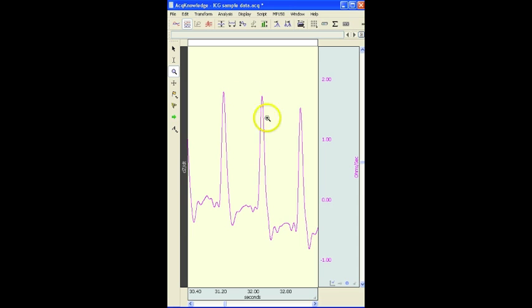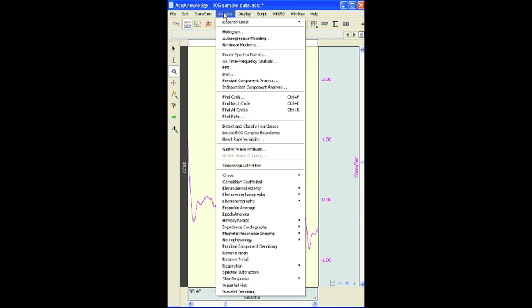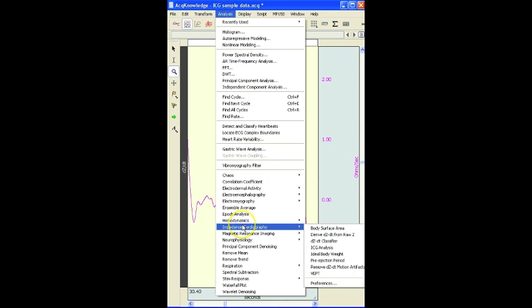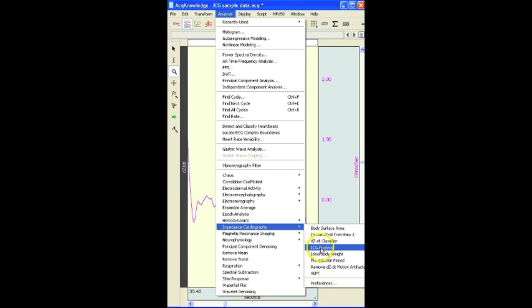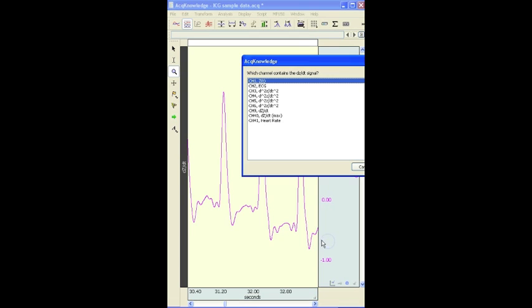The first thing you need to do to run the analysis is come down into the analysis menu and locate the Impedance Cardiography option. There's a series of routines available. The one we're going to focus on is DZDT classifier.